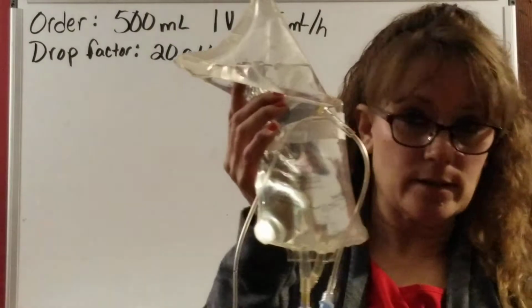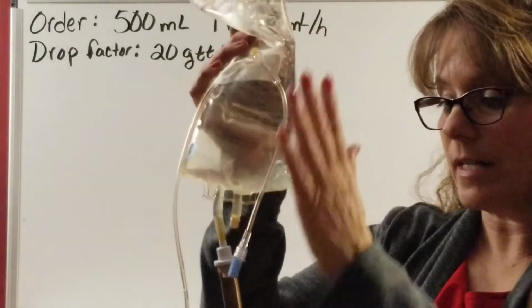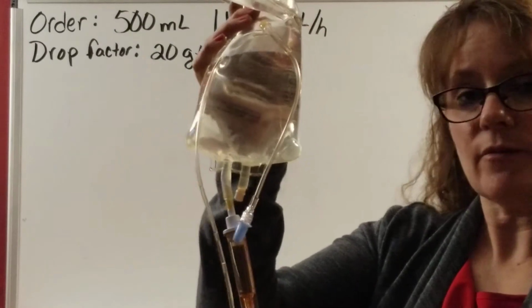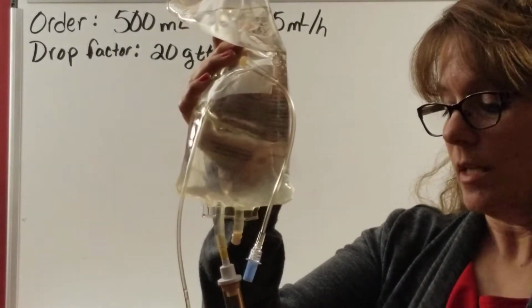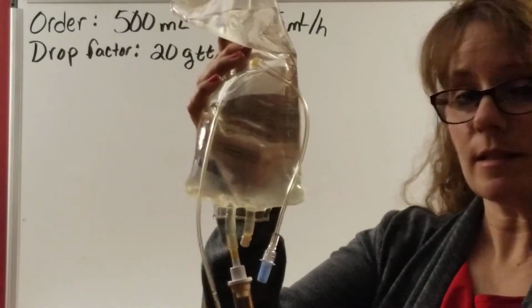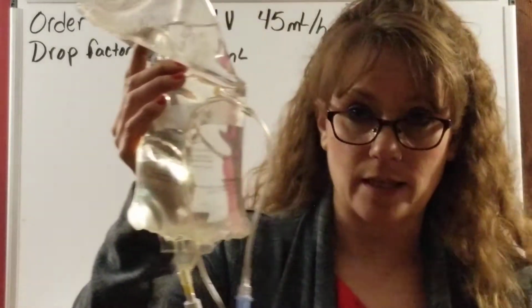So during the process, just a little quick reminder, they can change out the IV bag, but the drop factor doesn't get changed out. It's connected to the IV and to the patient, unless something really bad goes wrong or they have to replace it. But usually that doesn't get replaced.